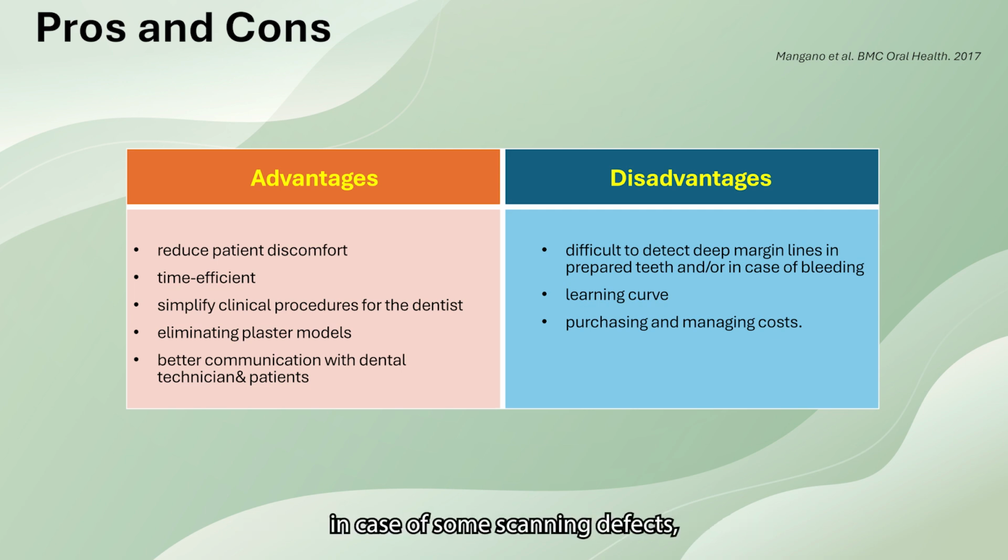In case of some scanning defects, clinicians do not need to retake the whole impression and just need to rescan some areas only. The major disadvantage is the cost. However, the learning curve is short and easy to learn.